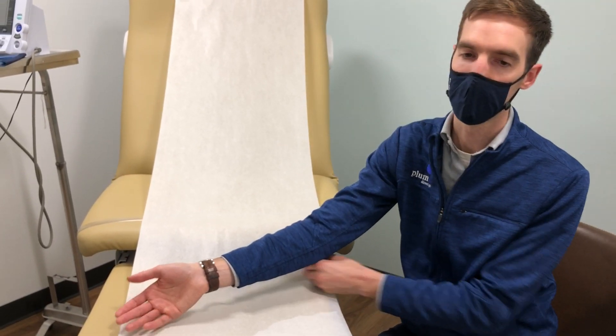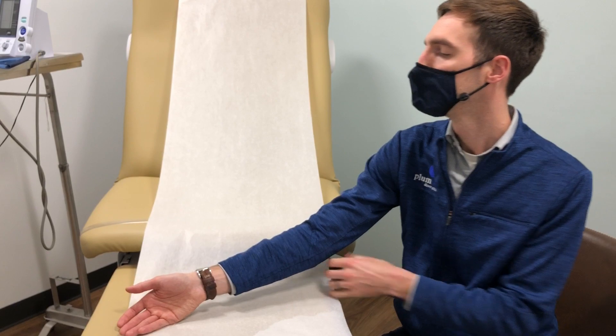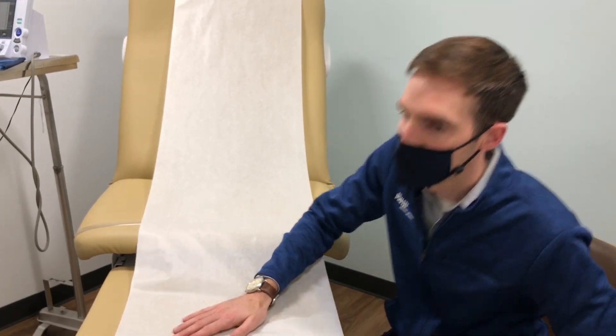That's the technique. Of course we draw the blood here and then we bring it over to the laboratory — we'll walk over to the laboratory now.